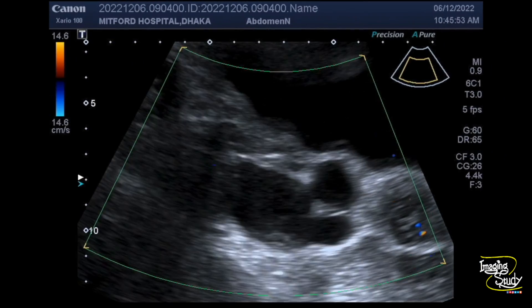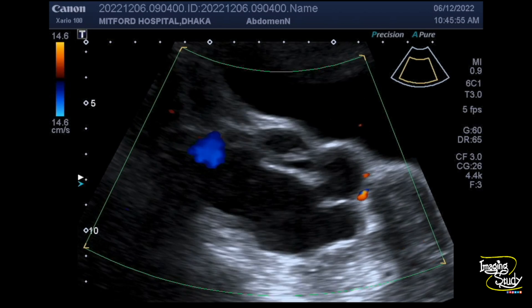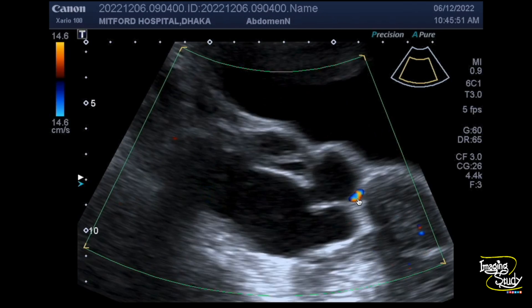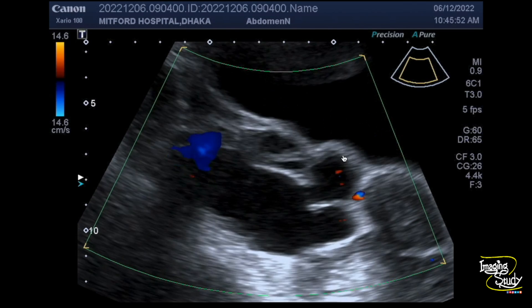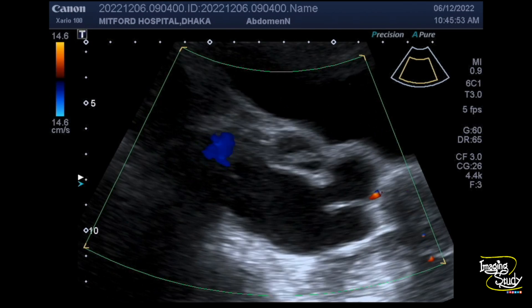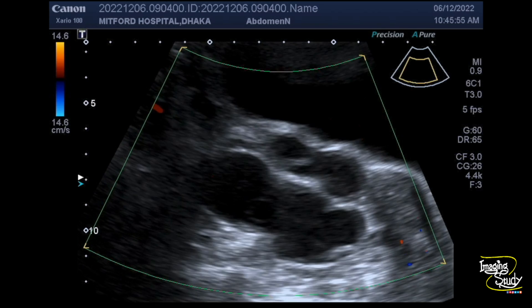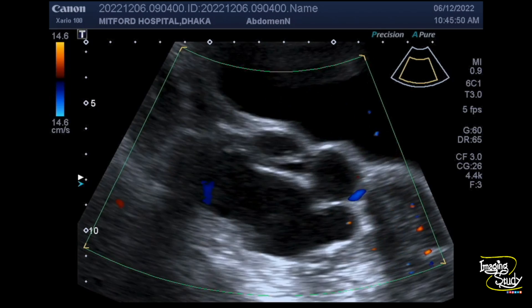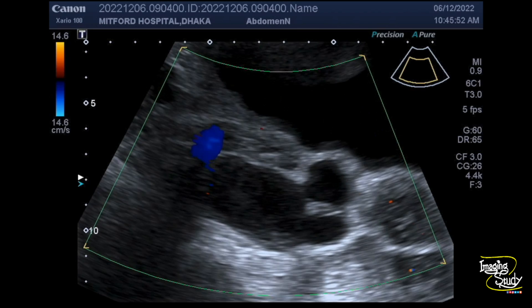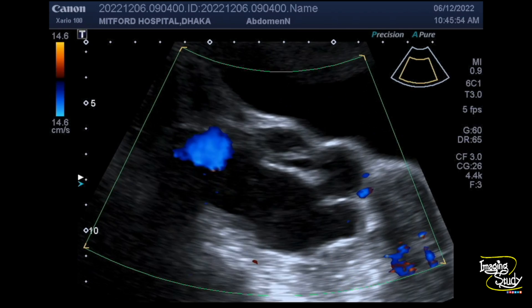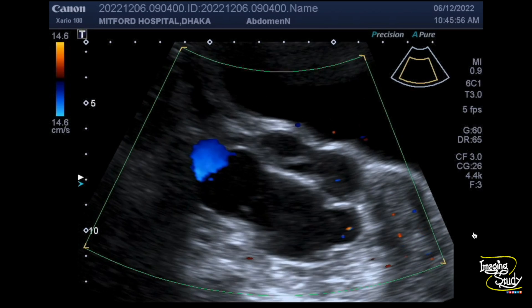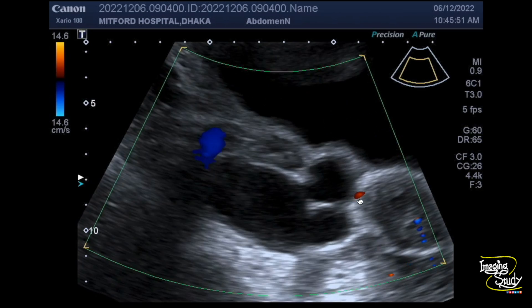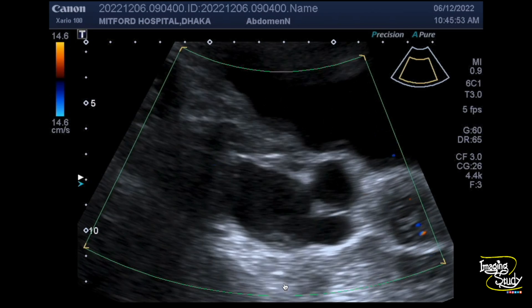Here we have applied color Doppler. You can see there is no apparent internal vascularity within the cystic spaces. If these cystic spaces were filled with blood, then it would be a case of pelvic congestion syndrome, where the parauterine and ovarian veins get dilated — we have already posted a video about that on our YouTube channel. Here you can see some tiny vessels around, which are the utero-ovarian vessels.